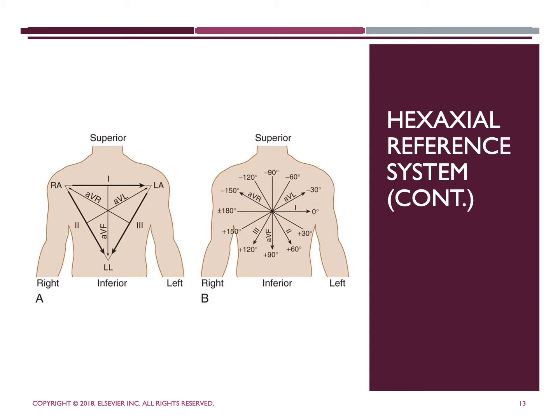What I want you to also notice is that leads 3 and AVL are positioned on opposite or reciprocal sides of the hexaxial reference system.